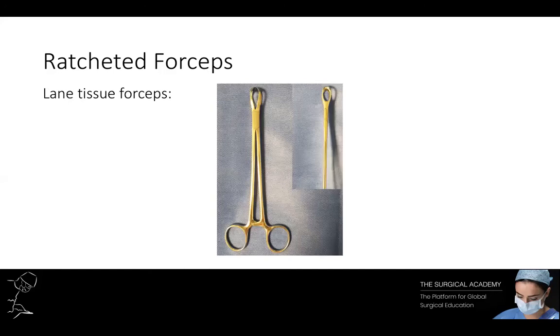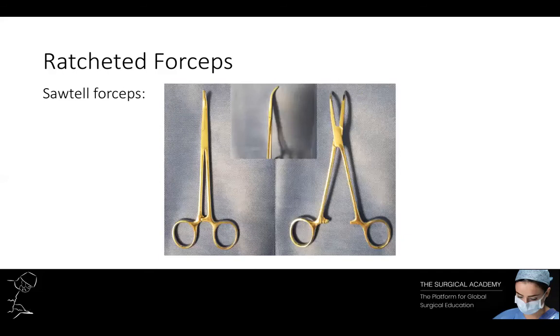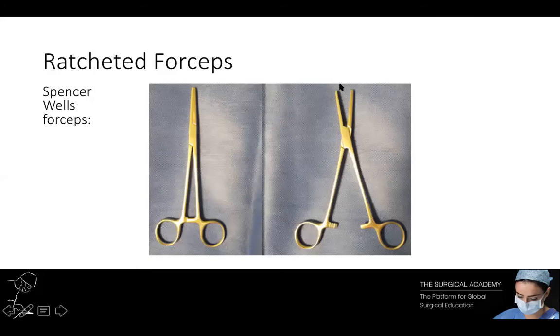Here you can see Lane tissue forceps. These have interlocking teeth allowing grasping of tough tissues such as fascia. Here you can see Littlewood forceps. These are Sawtelle forceps — as you can see these have a curved end. And lastly we have Spencer Wells forceps.